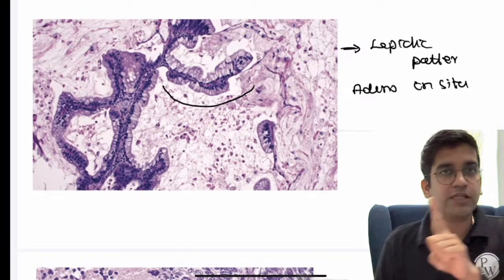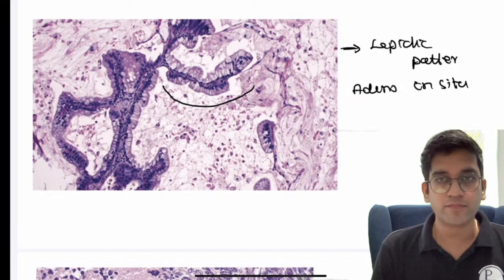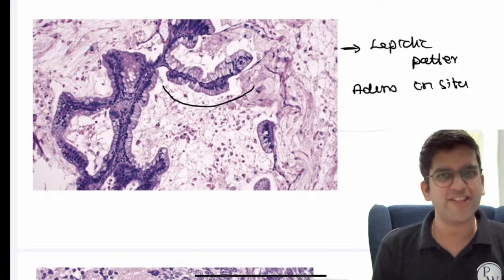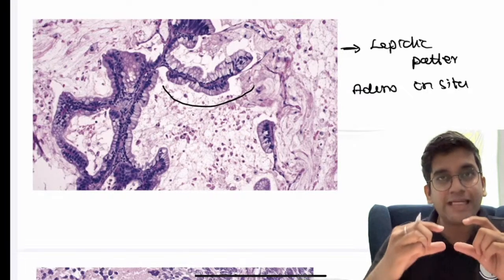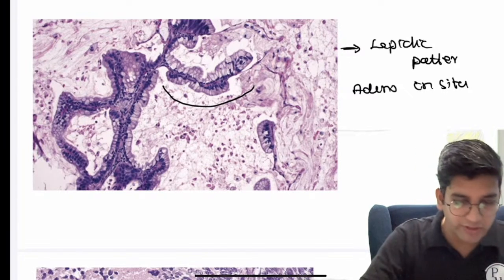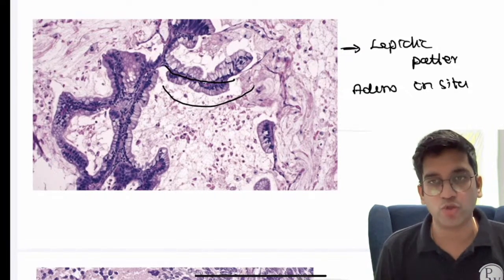The main difference between adenocarcinoma in situ versus adenocarcinoma, what's the only difference? It's invasion, right? So it's very difficult for an undergraduate to pick up invasion. If you see the pink interstitium in between two alveoli, it's invaded. If you don't see it, like this is an alveolar membrane here, I don't see the pink interstitium, so I call it an in situ lesion, right?